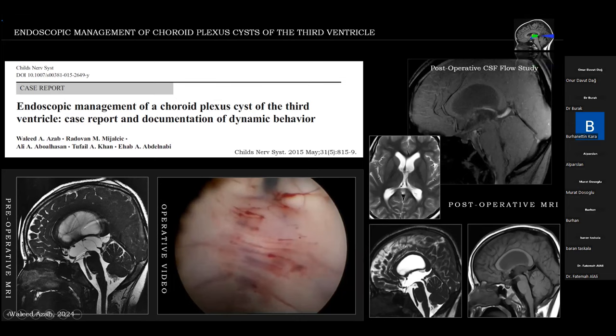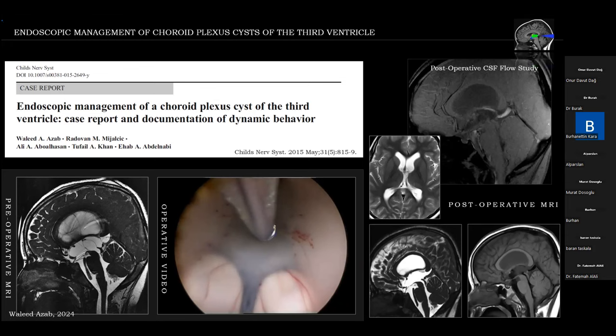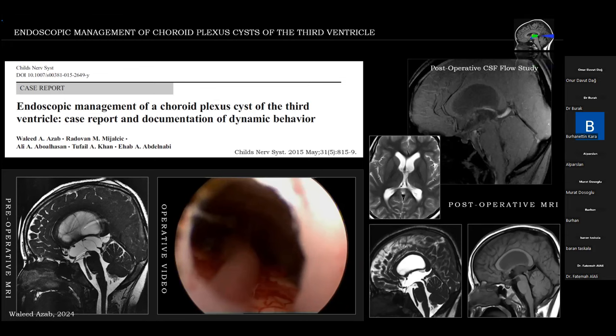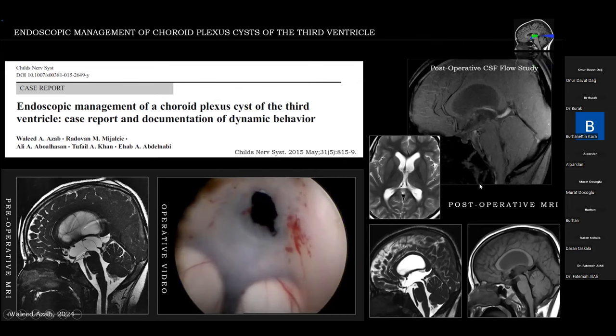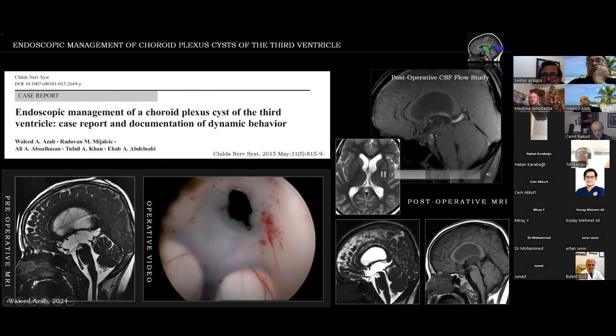A view of the aqueduct of Sylvius and the posterior third ventricle is seen. I decided to also do an ETV in that patient, although theoretically the CSF pathway has been opened and it should not be necessary — but I felt it was better to do so. Post-operative MRI revealed very nice decompression of the ventricular system, good flow across the ETV, and also across the aqueduct. Flow voids are seen on the sagittal MRI.